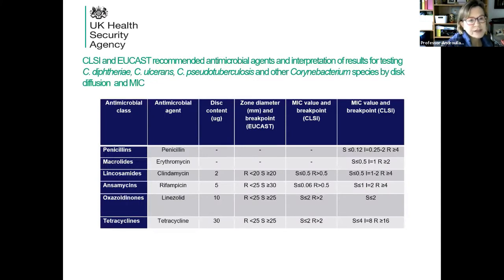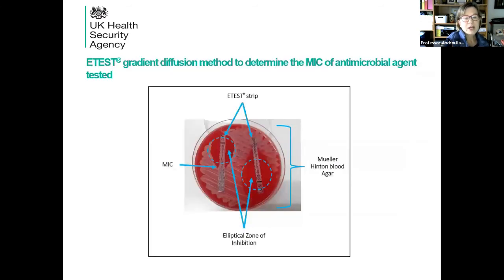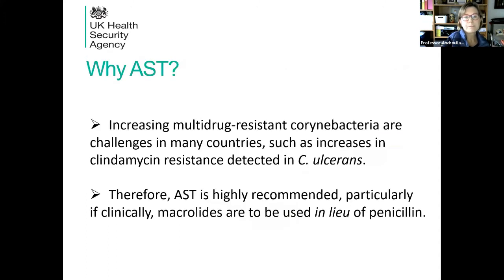These are the CLSI and EUCAST recommended antimicrobials and the various interpretations. And we tend to perform our ASTs using the E-test gradient diffusion method, which I'm sure many of you are very familiar with. Again, all the methods are in detail in the manual.